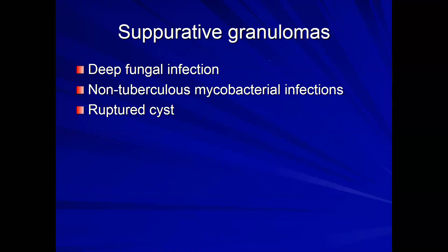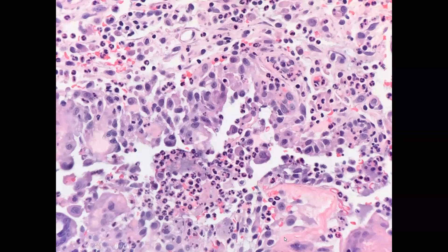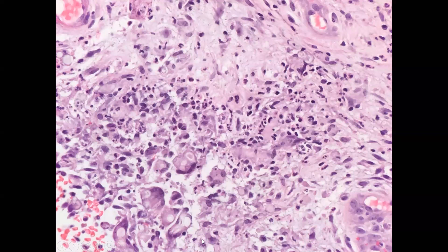Finally, suppurative granulomas — if it is not a ruptured cyst (the most common cause), think infection first until ruled out: either deep fungal or non-tuberculous mycobacterial infections. Here in the dermis is a dense collection of inflammatory cells — histiocytes filled with neutrophils. On closer inspection, you start to see little round shapes that are the cell walls of blastomycosis. These infection patterns will be covered in more detail in the infections chapter; the goal here is to identify the granuloma patterns.